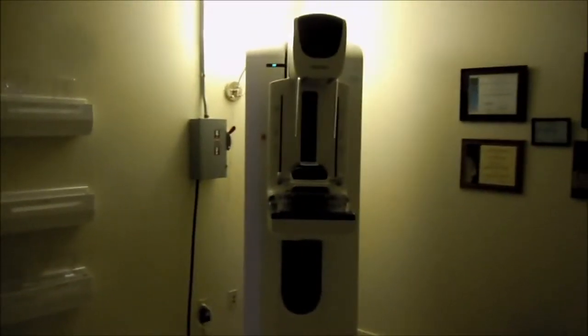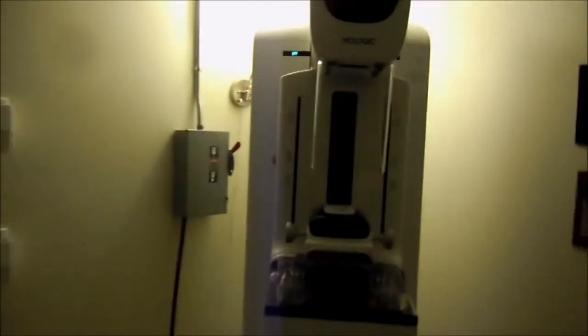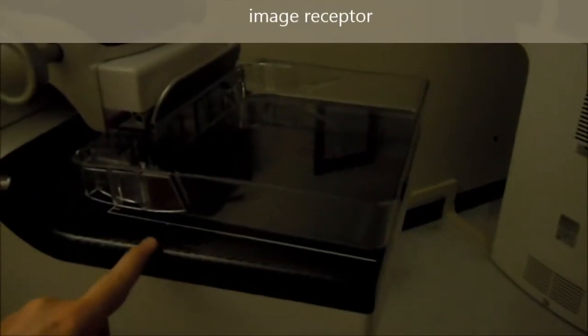This is a Selenia mammo machine. It's the tube, face plate, grid, used to be called the Bucky, compression tray, foot pedals.